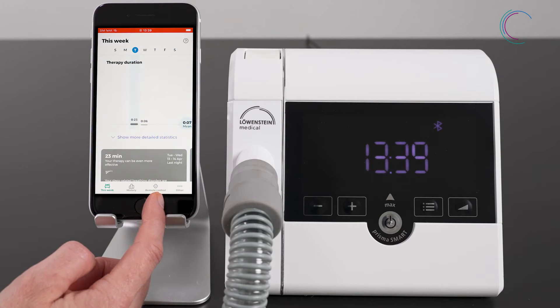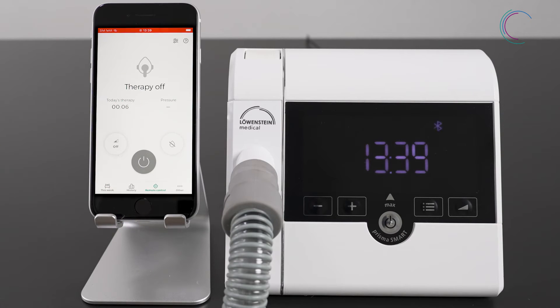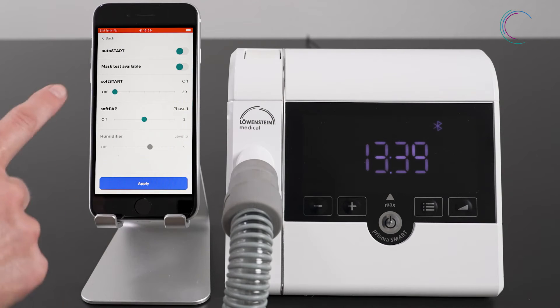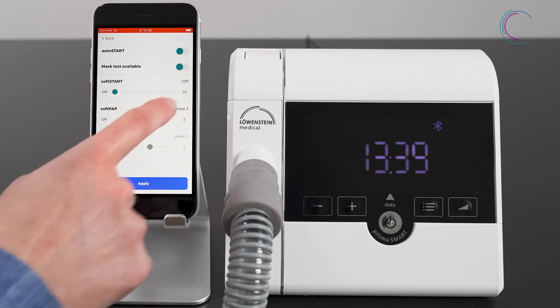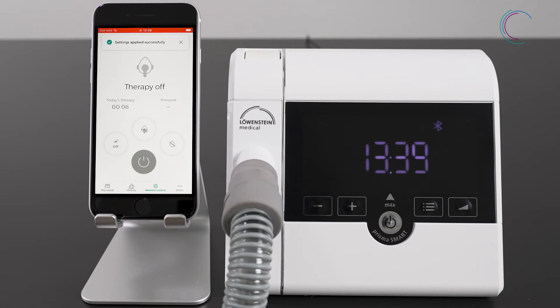Go to remote control. To activate the mask test, go to the settings. Here you can activate the mask test. Apply your setting changes. Now you will see the mask test symbol in the remote control.